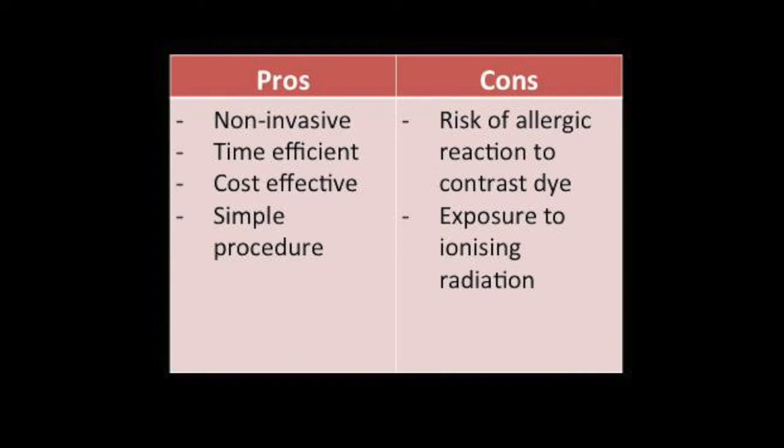This modality is non-invasive, relatively quick, and its cost aligns with its positive diagnostic outcome, being around $0 to $300 out of pocket with either a GP referral or bulk billing. But in saying this, as X-rays are used, there is an amount of radiation that will be exposed to the patient, which remains a major limitation of this modality, and also the possible side effects and an allergic reaction to the contrast dye.